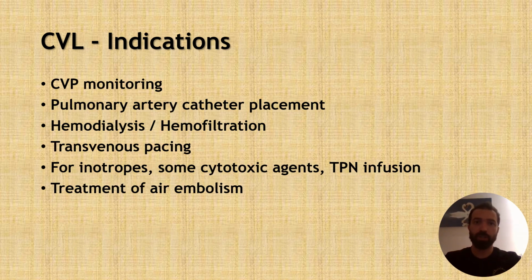Other indications include pulmonary artery catheter placement, hemodialysis or hemofiltration, transvenous pacing, and certain drug administrations. It is especially necessary to administer some cytotoxic agents and vasopressors or inotropic agents through a central line. Otherwise, venous irritation, phlebitis, and extravasation may develop.